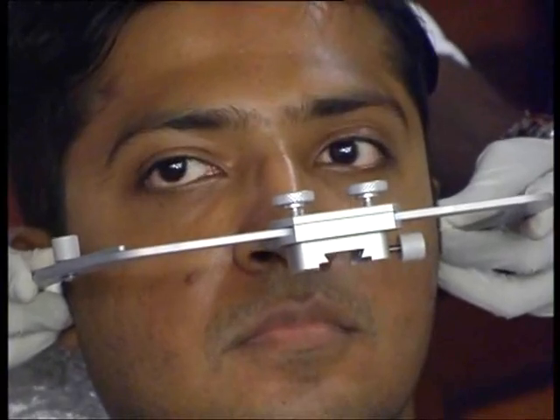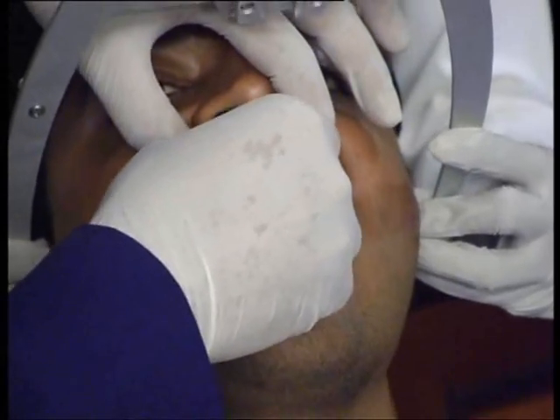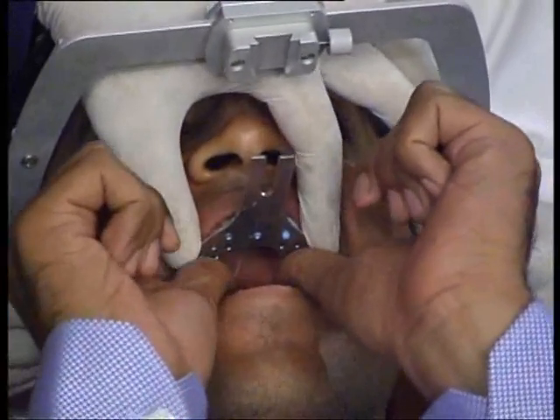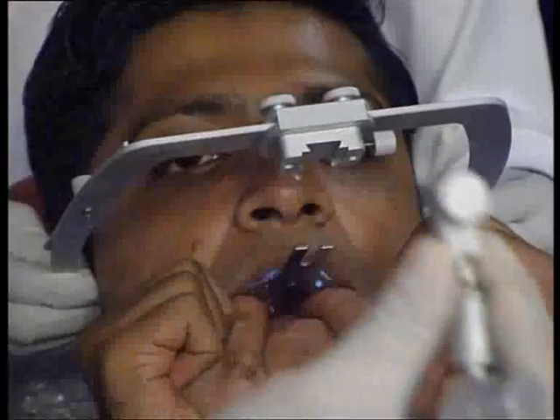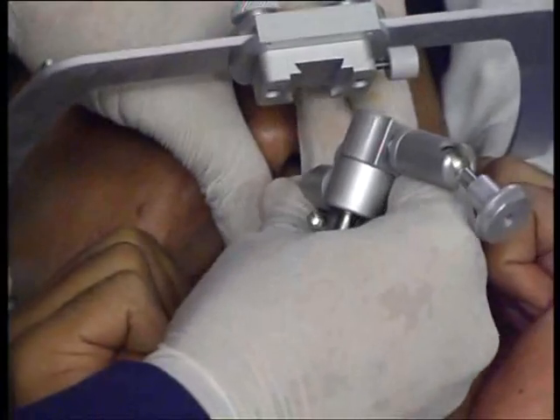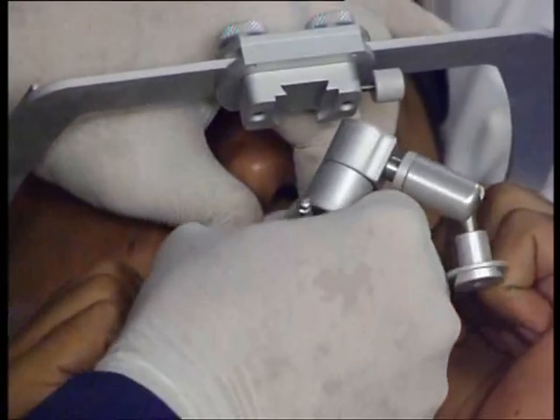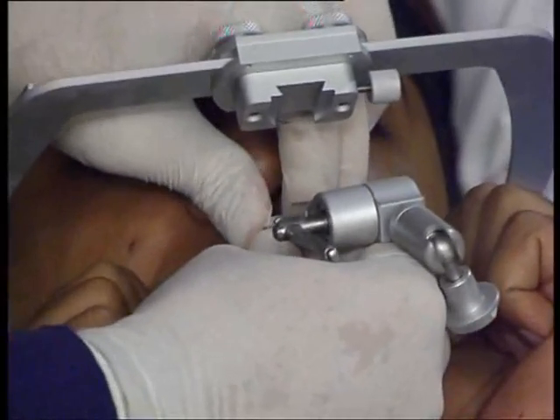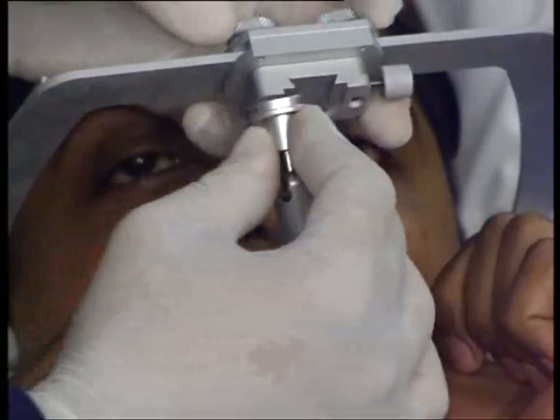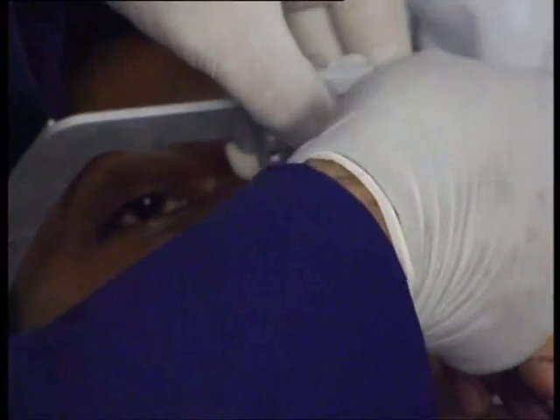Now this is where your two posterior reference points are in plane. You will put your bite fork back inside. This is how the patient is to hold it. The flat end goes in like this — locked inside. The other end, see this groove here? So this fits into this groove.